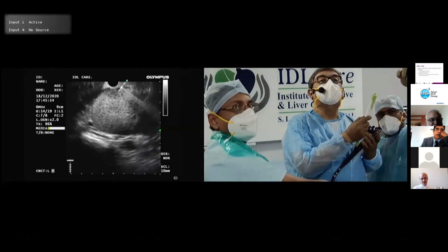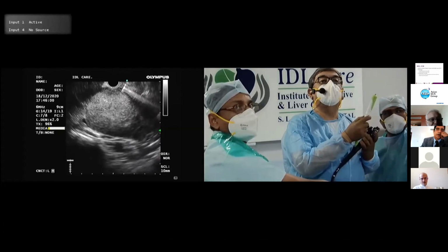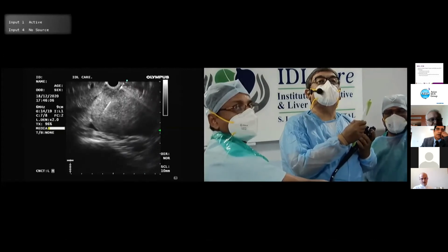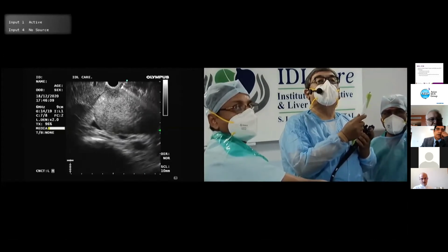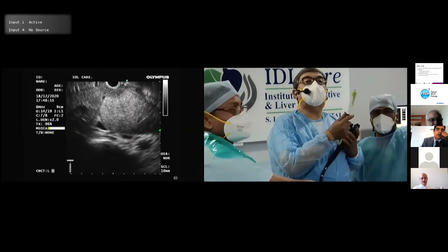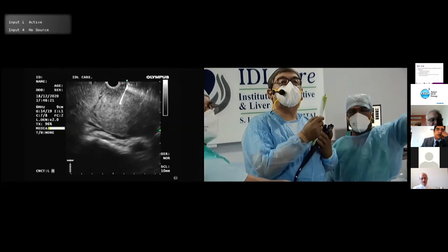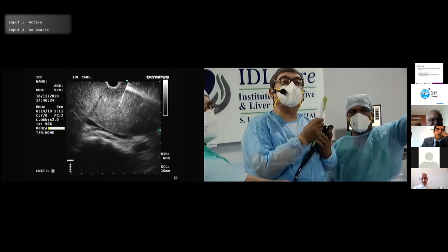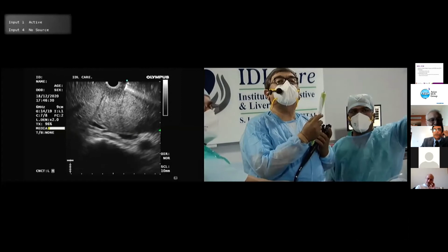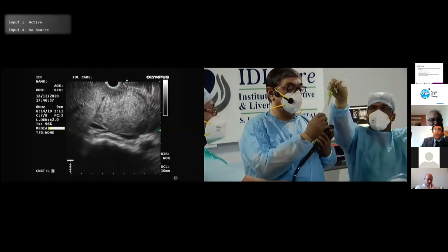See what I am doing? Every millimeter I go in. See, I change my elevator. Go in again, come out, change with the up down, go to a different area, take the biopsy from there. All the while Vikas is gently withdrawing. See? And you should not be in a hurry. Do it very lazily. Even the puncture should be very gentle. Allow the needle to scrape the tissue. Don't just quickly jut in and come out. I have seen people doing fatafat, 8-10 movements. That only causes more blood. So be gentle, be lazy, and I think we are done.